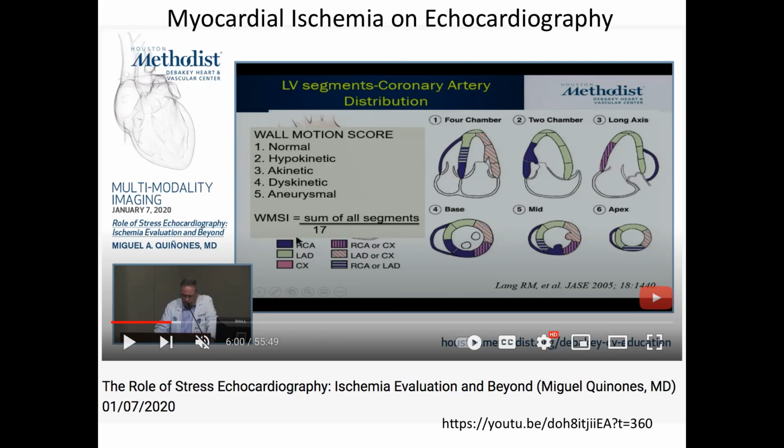If you're doing scoring of whether the muscle is contracting normally or not, there's kind of 5 buckets it can go in. 1 of 5 buckets: looks normal. Slightly down, in that it's not normal, but it's not stationary. Akinetic is when the muscle actually is stationary. It just doesn't contract, right? So those 3 are like, I'm contracting 20%, 10%, 0, in terms of shortening.